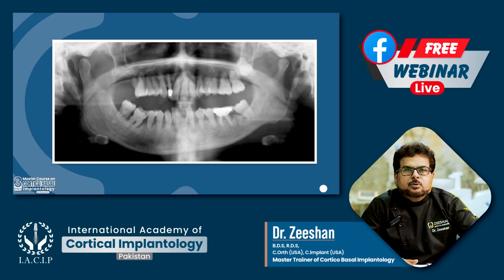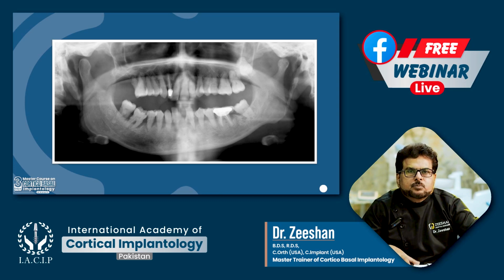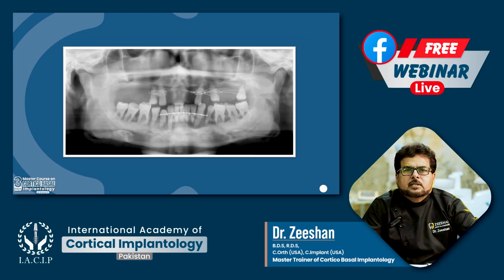Then we have to see the next slide, and after that we will conclude this case. Like for example, this is another case. See, the maxillary sinus is lying so low and you don't have even 1 or 2 mm bone over there, and the patient doesn't want to go for sinus surgeries, or even in the lower jaw you can see how much bone resorption is there.